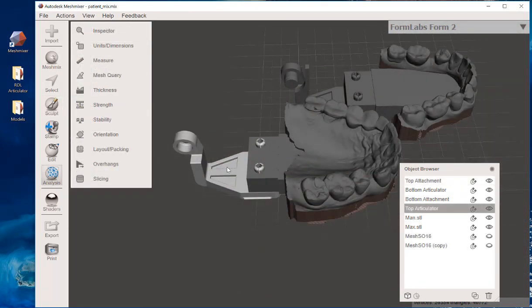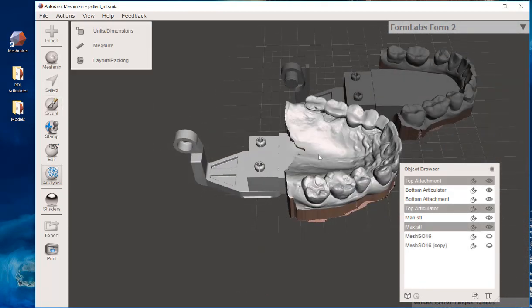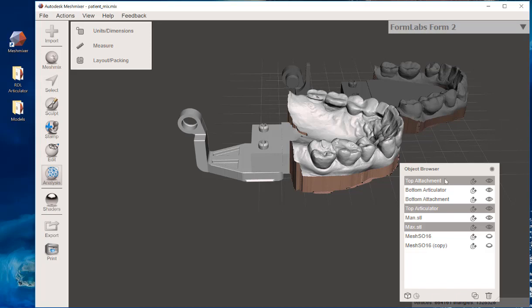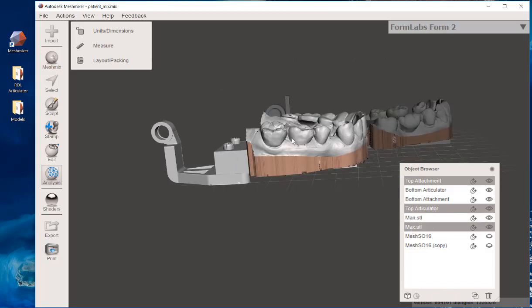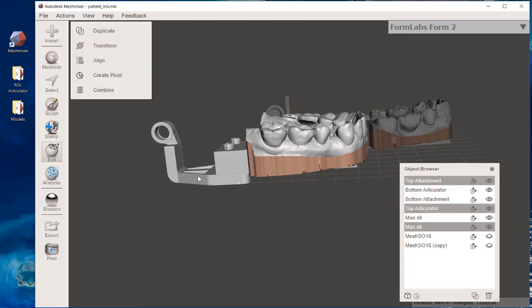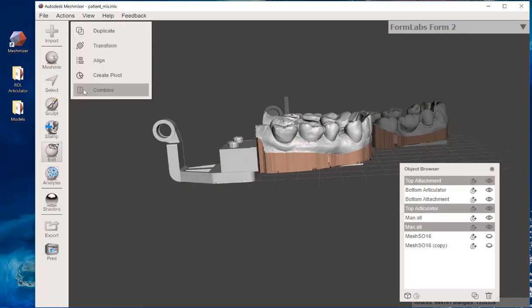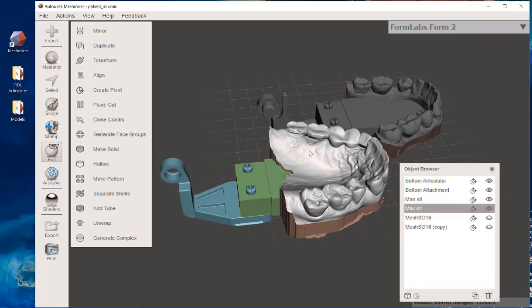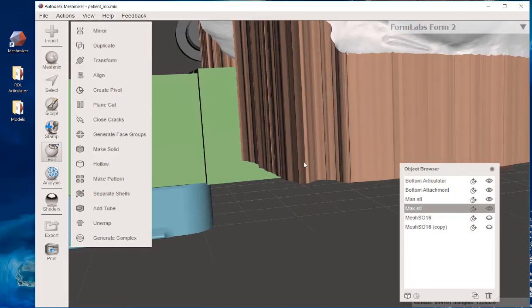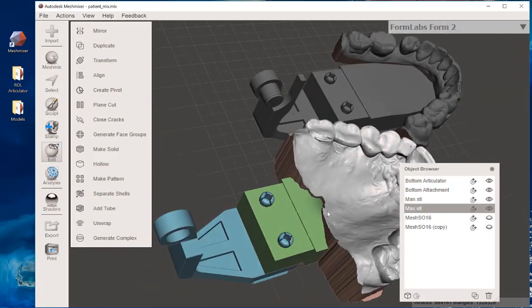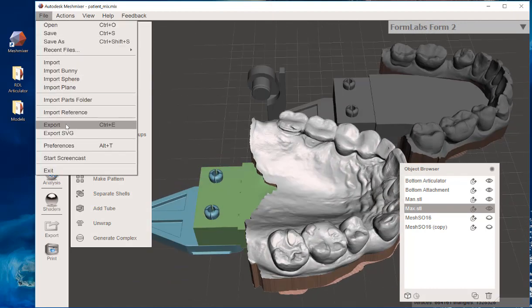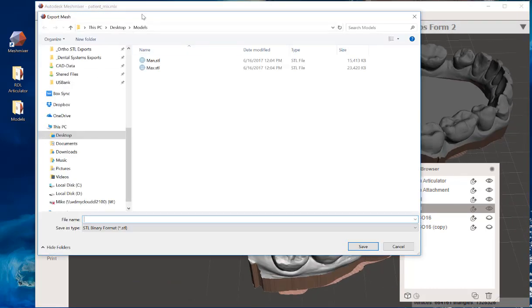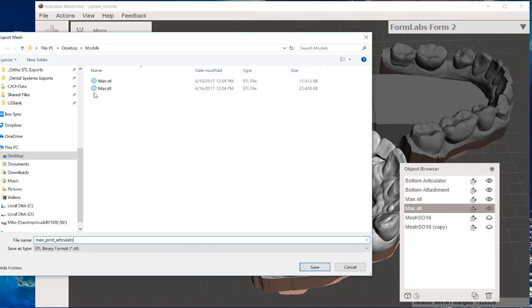You're going to left-click the Articulator, this file, and this file. It's going to be a total of top attachment, top Articulator, max.stl. And that's going to allow you to join all three of them together. When you do that, it's going to give you this combined function. You click that. When you do that, it's going to combine it into a single layer right here. It's going to come out with these kind of goofy-looking colors. Then all you need to do is click on File, Export. And when you do that, we're going to call this Man Print Articulation.